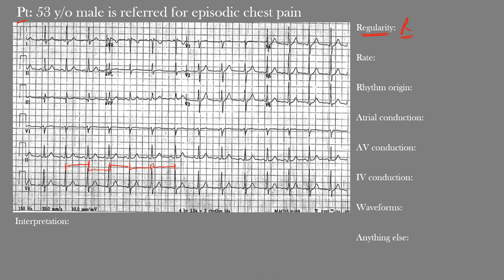The heart rate was 87 beats per minute. One way to calculate it: the EKG from beginning to end represents 10 seconds. Count the number of QRS complexes across and multiply by 6, since 10 seconds times 6 gives 60 seconds. Counting across gives us 14 complexes, and 14 times 6 equals 84 beats per minute — a close estimate to the actual 87.